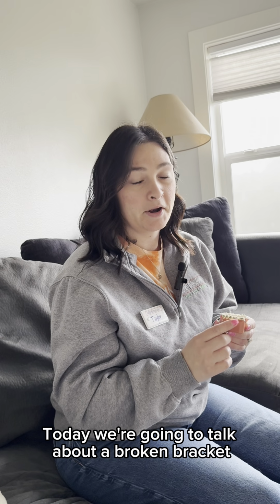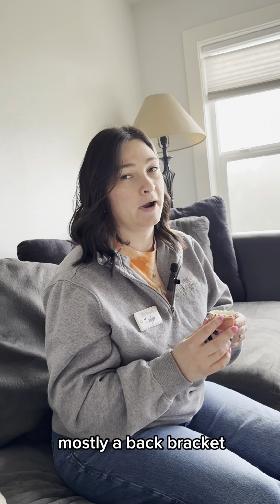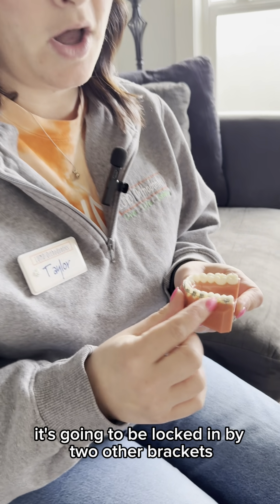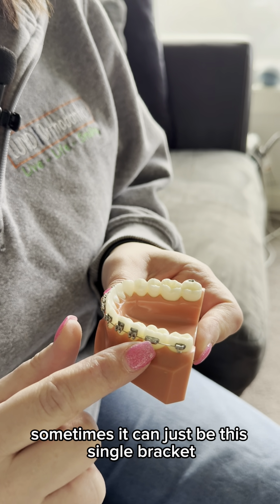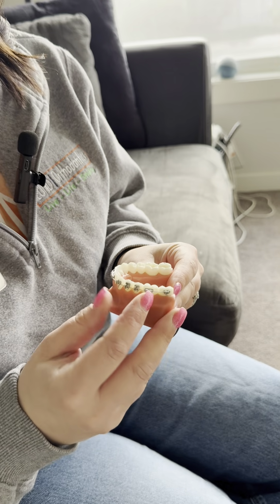Today we're going to talk about a broken bracket that is sliding on your wire, mostly a back bracket. When you have a back bracket that is broken, typically it's going to be locked in by two other brackets and it will be sliding back and forth on the wire. Sometimes it can just be this single bracket. In that case, it would slide off the back.